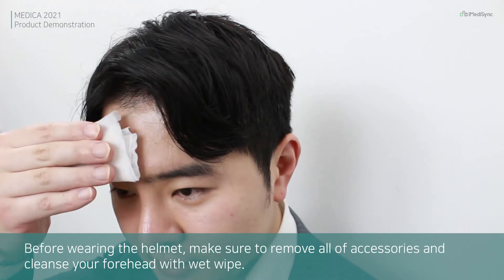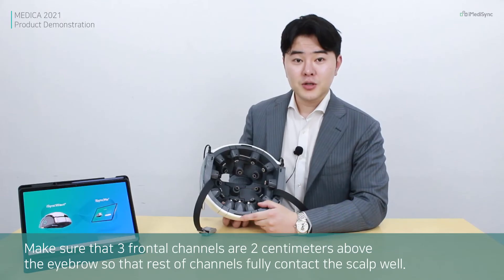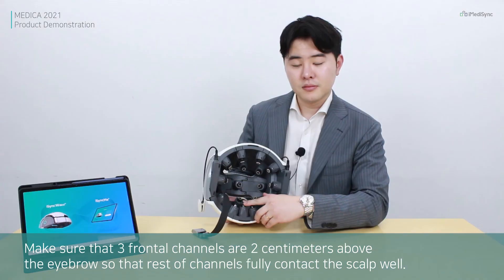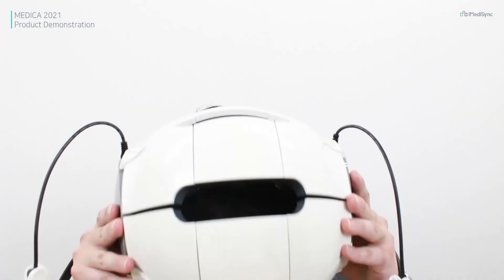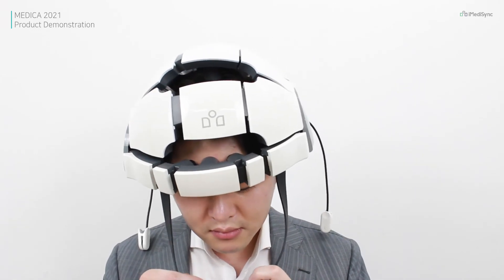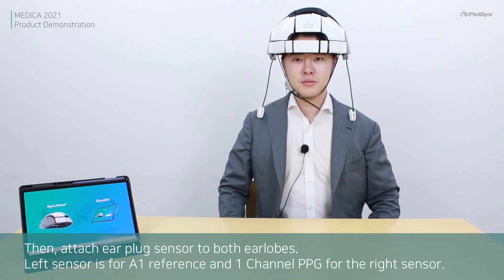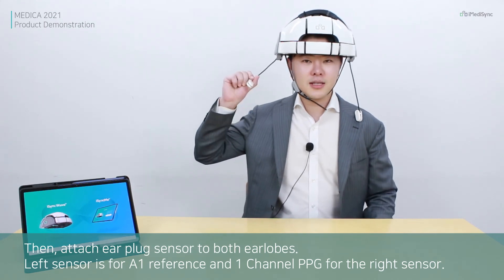Before wearing the helmet, make sure to remove all accessories and cleanse your forehead with a wet wipe. Ensure that the 3 frontal channels are 2 cm above the eyebrow so that the rest of the channels will contact the scalp. Now let's wear the helmet and attach the earplug sensors to both earlobes — the left sensor for A1 reference and the right sensor for 1-channel PPG.